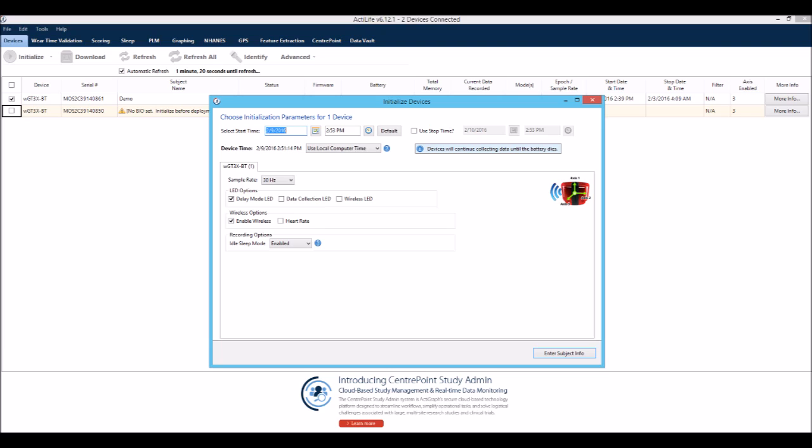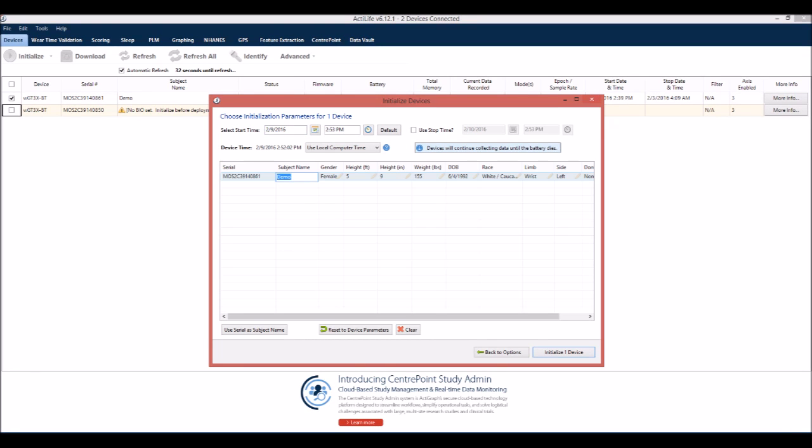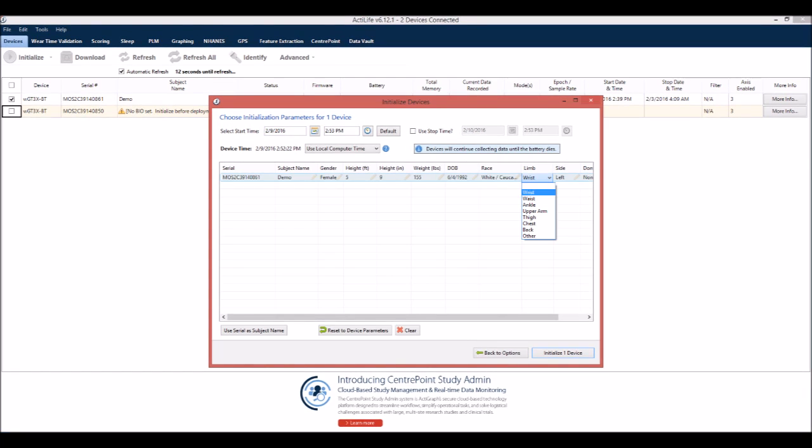If no stop time is selected, data will be collected until the battery is depleted. This is also the screen where you can enable wireless if you plan to use Bluetooth capabilities, including a compatible heart rate monitor. Now enter the subject name, information, and the wear position details into the grid.